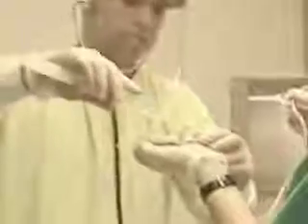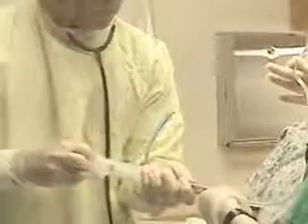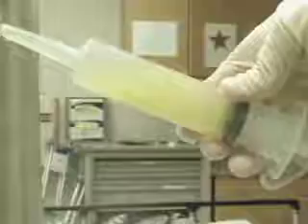Attach the catheter tip syringe to the main port of the NG tube and insufflate 30 cc of air while auscultating over the epigastrium. A gurgling noise should be clearly audible. Using the same syringe, aspirate the NG tube and ensure that it fills with gastric contents.